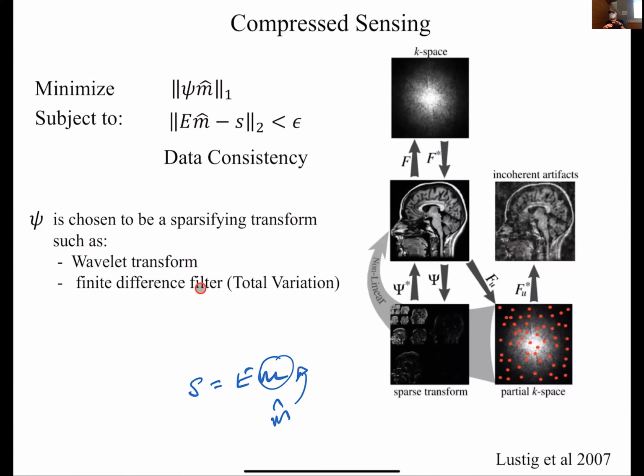So for example, if I have an image of just blood vessels, right? And if I imagine taking the derivative of that, then that's just going to have edges at certain locations, but it's not going to have edges everywhere. And so, if I can make some assumptions about what the smoothness of my data is, then I should be able to use that estimate to control the possible reconstruction.